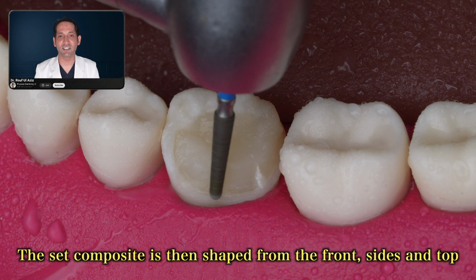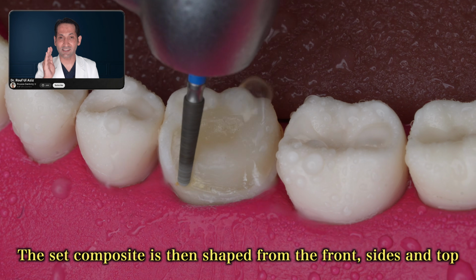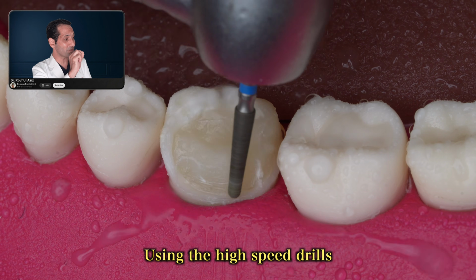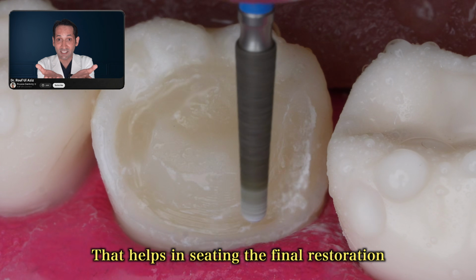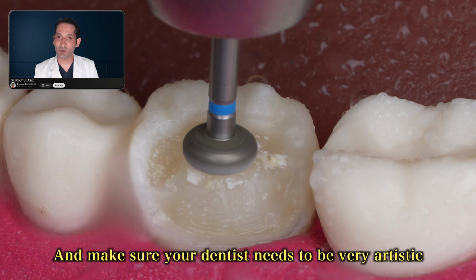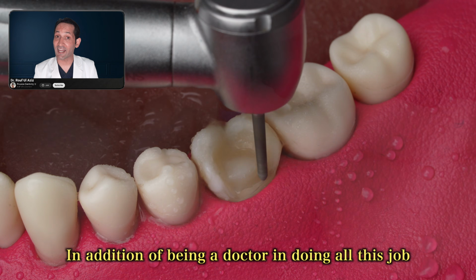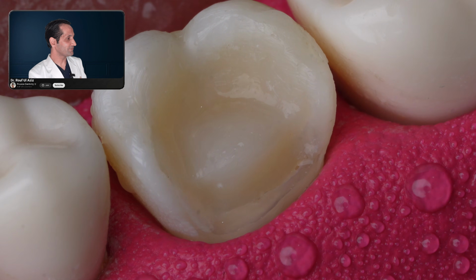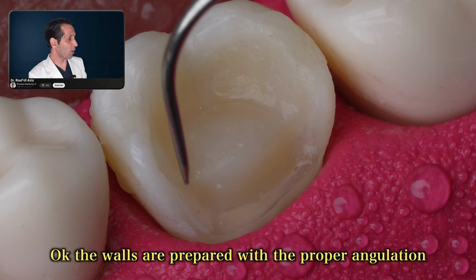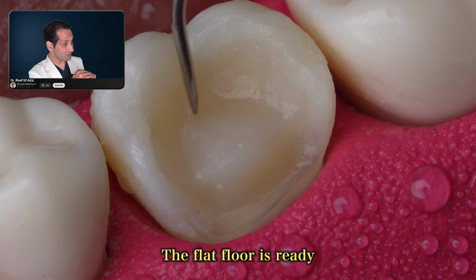The set composite is then shaped from the front, sides and top using high-speed drills, so that we will have the finished floor that helps in seating the final restoration. And make sure your dentist is very artistic in addition to being a doctor in doing all this job. Okay, the walls are prepared with the proper angulation. The flat floor is ready.